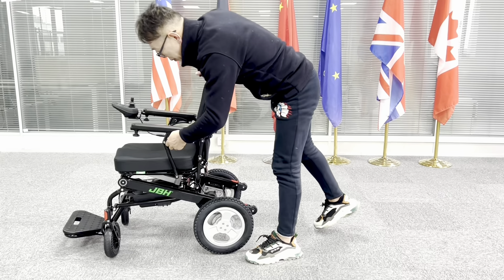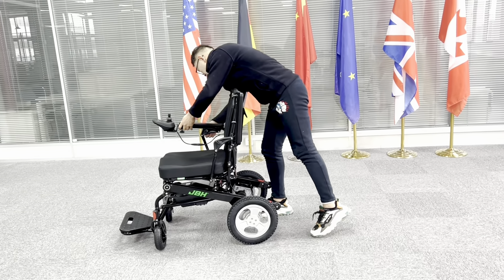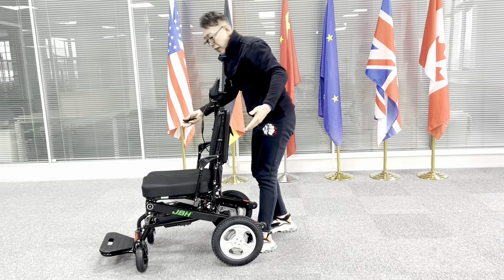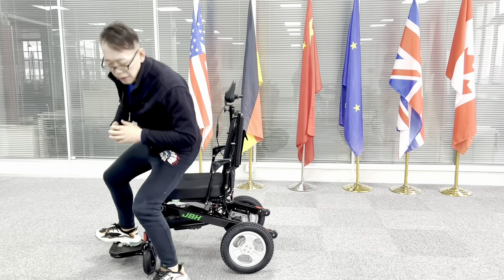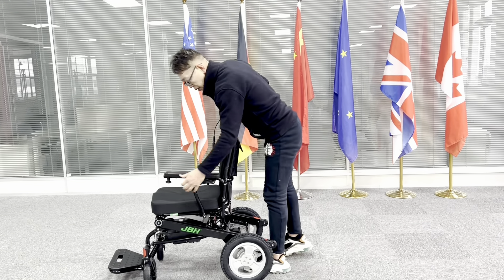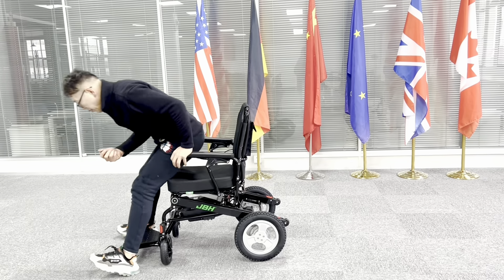To access the wheelchair is really easy. You can just lift up the armrest from here. Either you can access from this side or that side — it's very easy. Simply just slide in and then you can get in or out of the wheelchair very easily, or you can just access at the front.